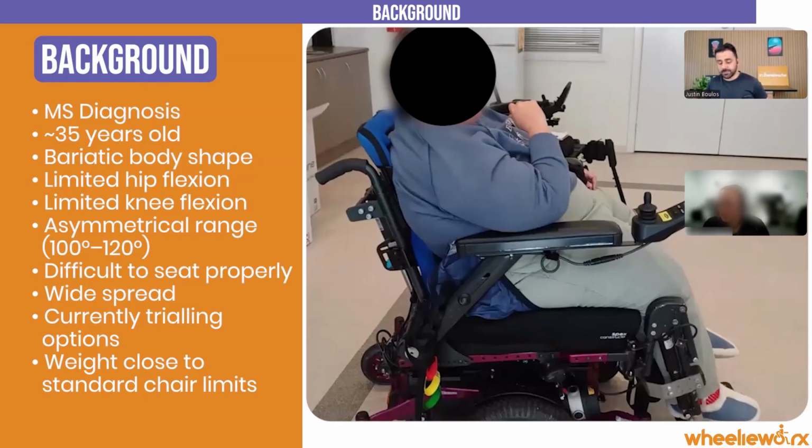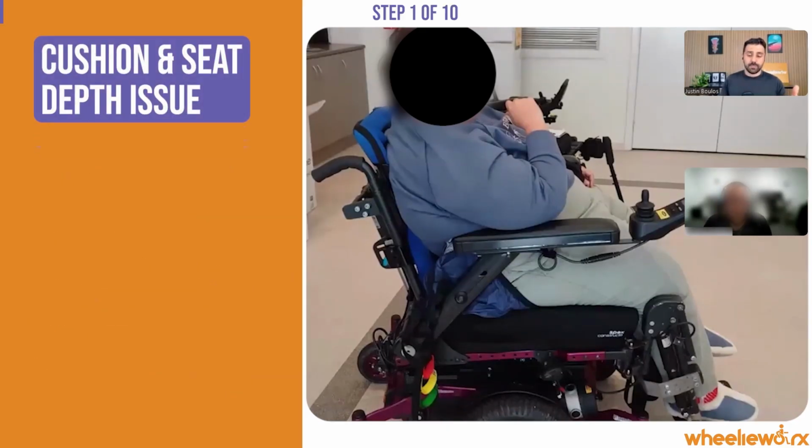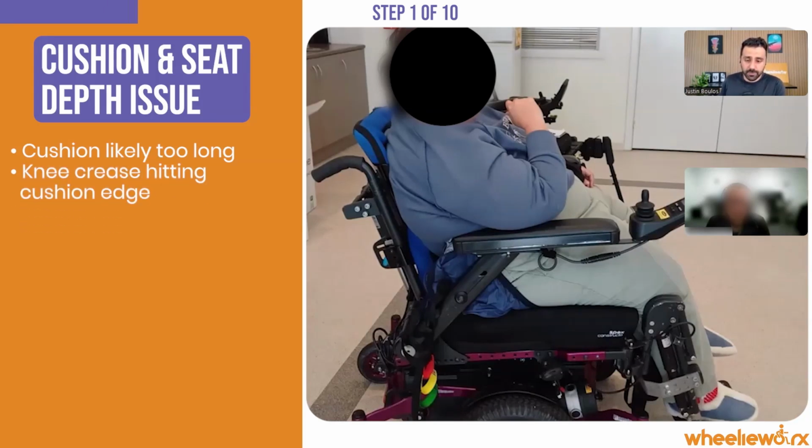The reason why I say that is because there's a couple of things here. One, if she's got limited hip flexion, how I would like to see her is in a shorter seat depth, but really opened up. So I want to picture her lying down, and then we want to see as she comes up, what is her hip range actually? Because right now she's in a lot of posterior tilt, and the cushion is accommodating for that, which she may not need to be in that much posterior tilt. So if we have, say, a 20-inch long cushion, she's never going to sit more upright than that, because her knee crease is all the way out the front of it. So I don't even know if we can get, maybe this is how she needs to sit, maybe it's not. But either way, it's not ideal.